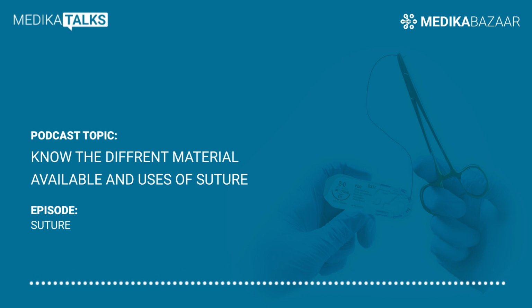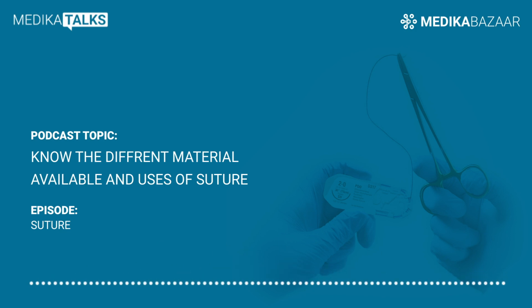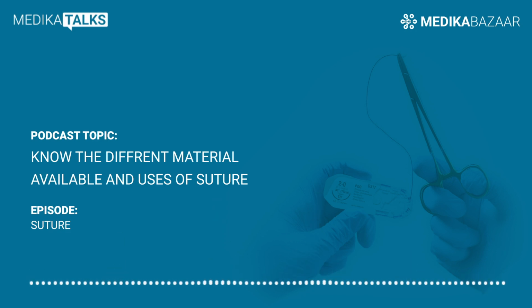Suture needles are usually made of stainless steel and are composed of the following elements: the needle point, which gently pierces the tissue, starting at the body's maximal point and running to the needle's end. It can be sharp or blunt. The blunt suture needles are designed to penetrate into muscle and fascia. They can be used to reduce the risk of potential bloodborne infections arising due to needle stick injuries.